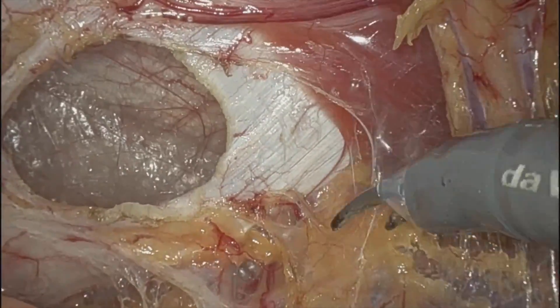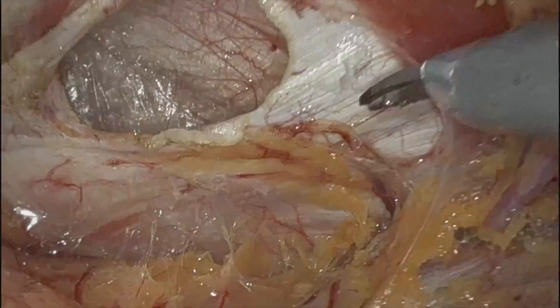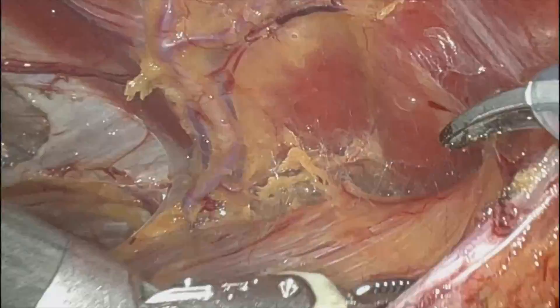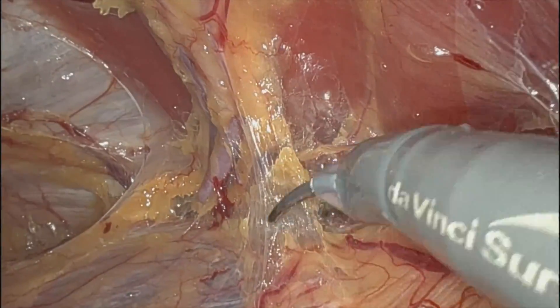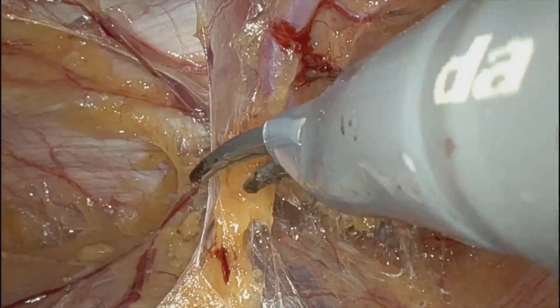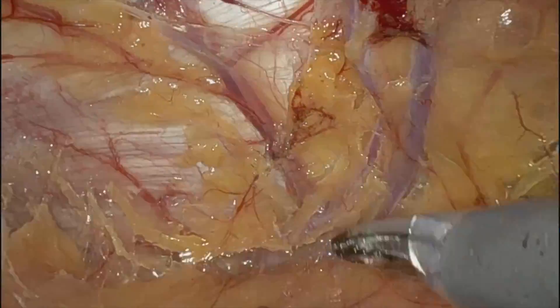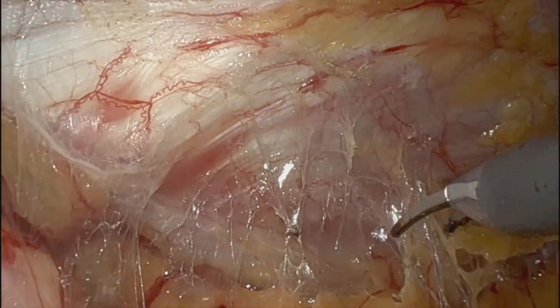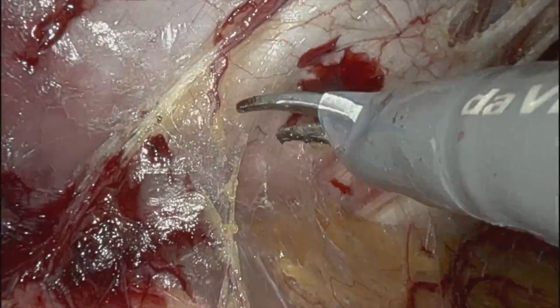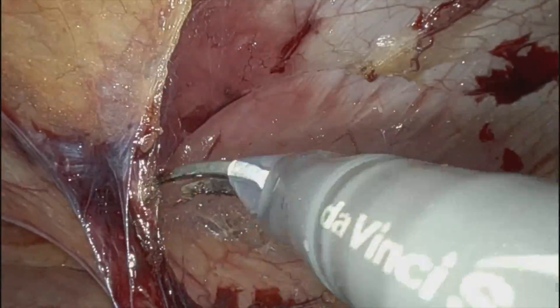Here I'm just taking this defect down, taking the peritoneal flap down. Just making sure I get good coverage. I did use a Bard 3D Max mesh for this — mimicking and consistent with what I would do for an inguinal hernia.